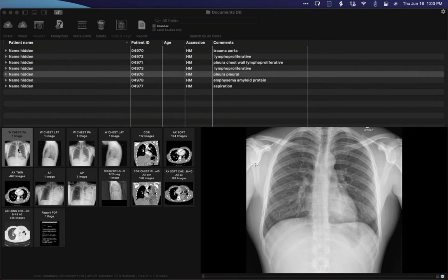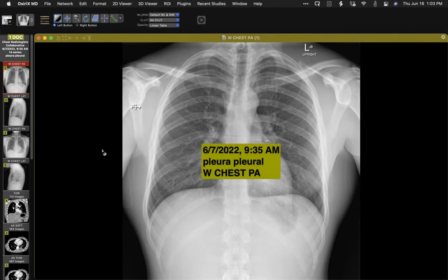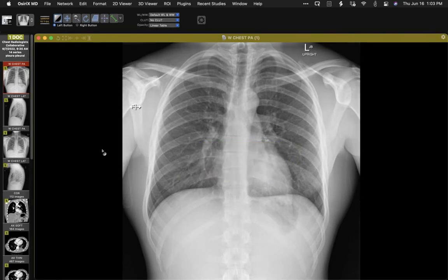This first patient, I'll show you things not quite in order, but I do want to show you the chronology. This is June the 7th, and at that time, at least viewed in retrospect, there is a rather subtle opacity here in the left lower lobe — perhaps not quite a full segment in size, but approximately.